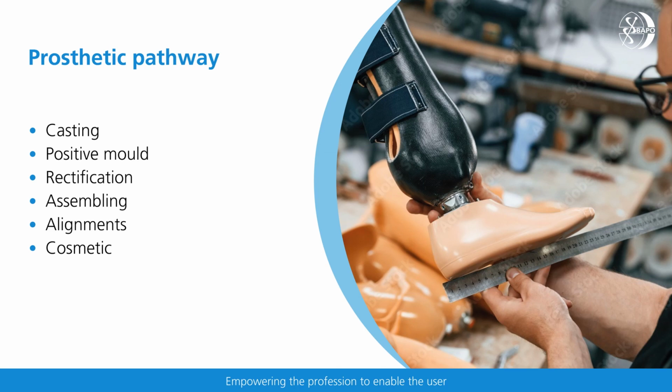Support workers alongside prosthetic technicians may be involved with these various stages. There is a basic overview for each stage featured on physiopedia.com called Lower Limb Prosthetic Introduction that may be of interest to support workers.